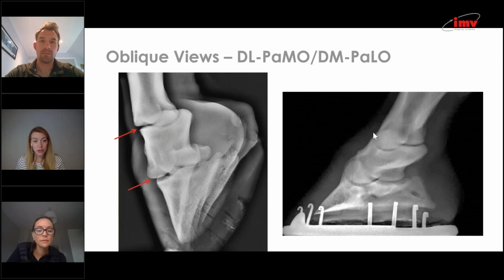It is possible to support the limb and hold the plate, but again, that's handler dependent and also horse dependent, because often you need someone to hang on to that leg even in a well sedated horse. So pros and cons, but personally I prefer the flexed one, but a lot of really useful information does come about from the weight bearing one as well, so it's still beneficial to acquire it, definitely.